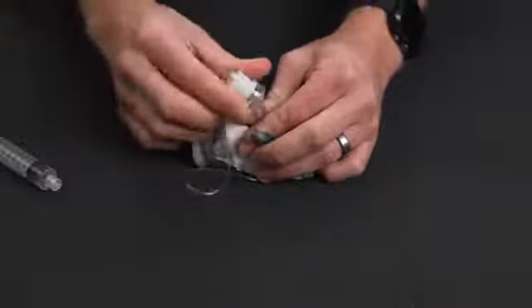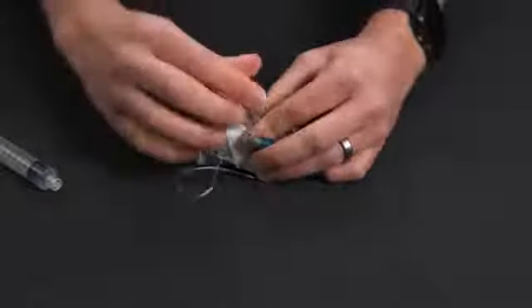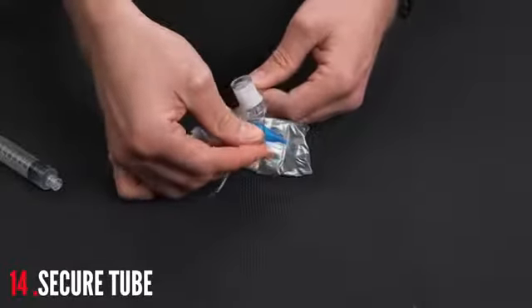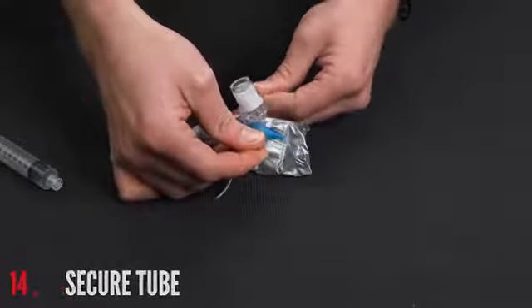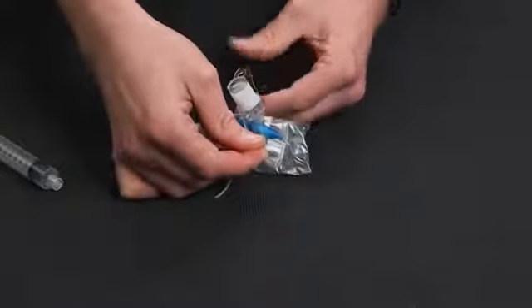And we're going to take a bag valve mask and we're going to bag over top of this. You can take these wings, if it's inserted far enough, and you can actually tie this down on either side of the patient. Just make sure you're not providing too much circumferential pressure around the neck.